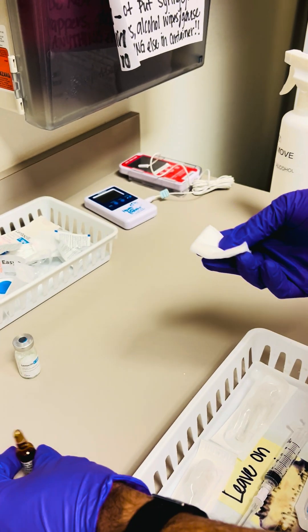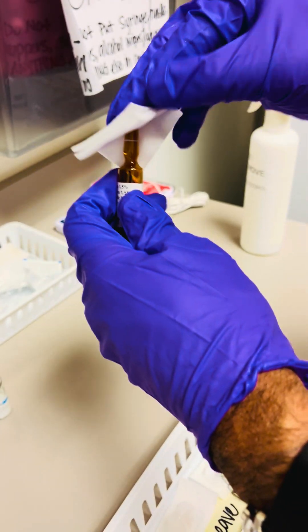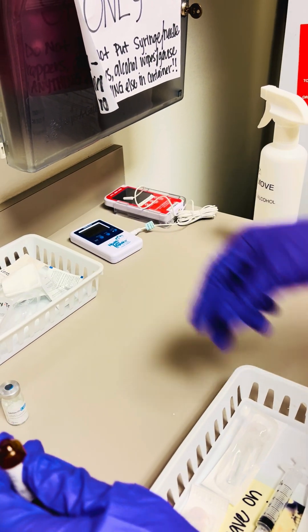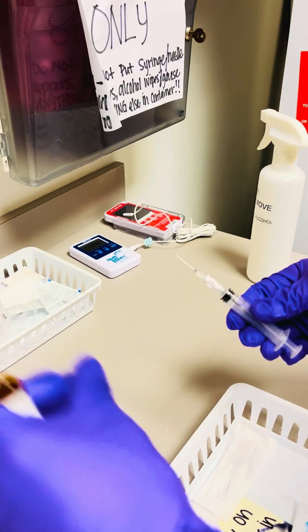Now with some gauze, you'll grab the ampoule with the dot facing away from you and snap it open. Dispense of the glass top and then draw the entire contents into the 5 ml syringe.